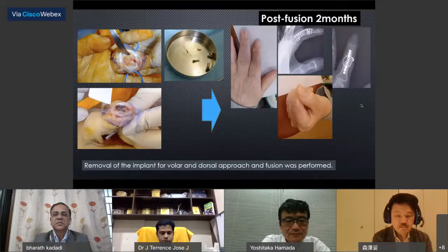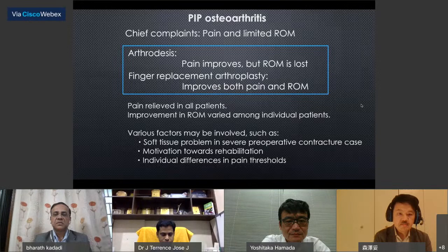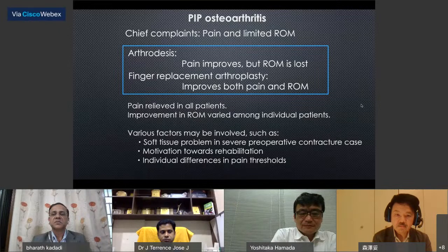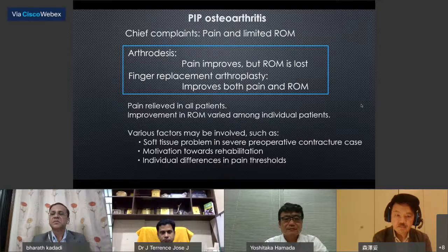Discussion. Chief complaints in PIP osteoarthritis include pain and limited range of motion. Also, fusion improves pain, but range of motion is lost. Finger replacement arthroplasty improves both pain and range of motion after operation. All our patients had no pain, but individual differences were observed in range of motion improvement.